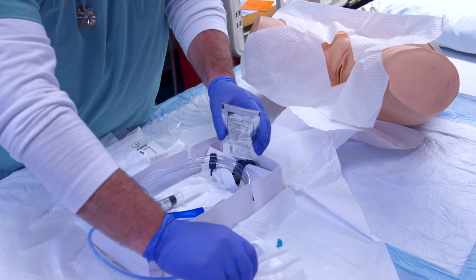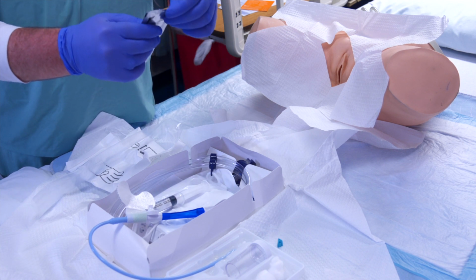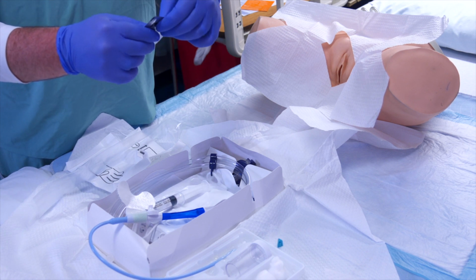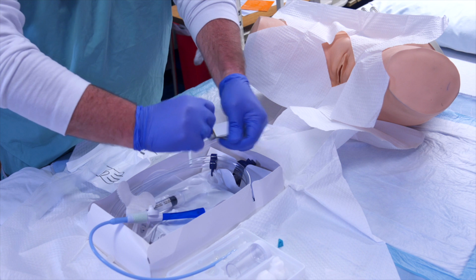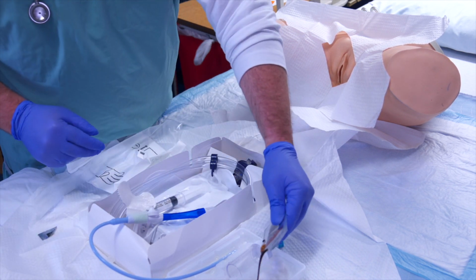Prepare the insertion site in a sterile fashion by retrieving prepping solution and forceps. Use the forceps to separate the cotton balls. Open the prepping solution and pour over the cotton balls, saturating them evenly.